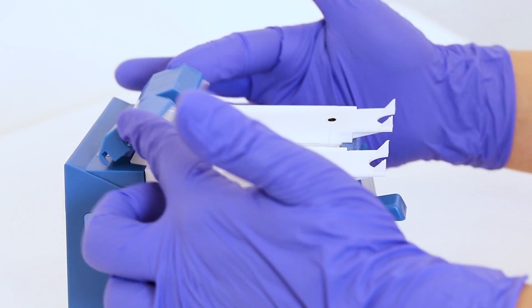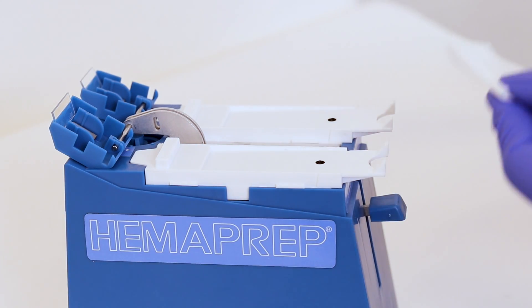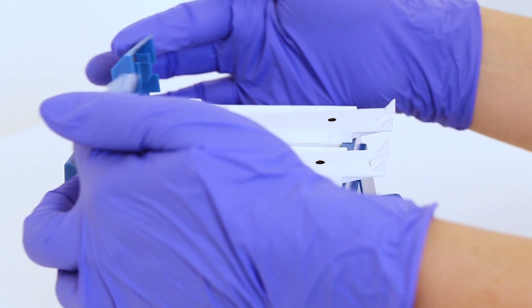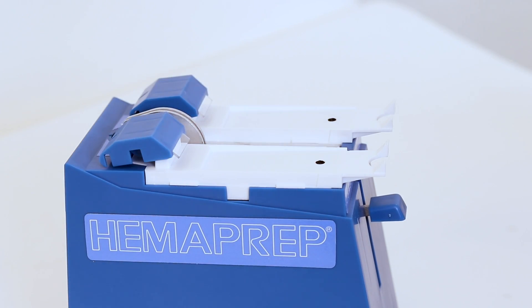To clean the spreader blades, lift the spreader arms and wipe gently with water. Let it dry and then put the spreader arms back. Press and release the plunger once to make sure that the arms are seated correctly.